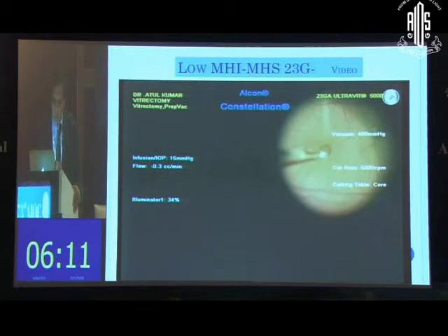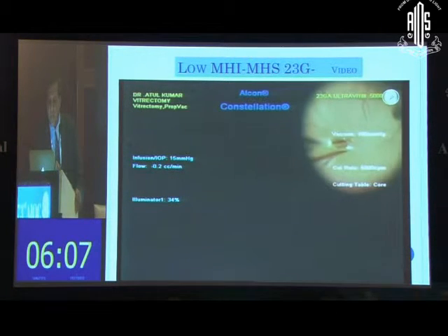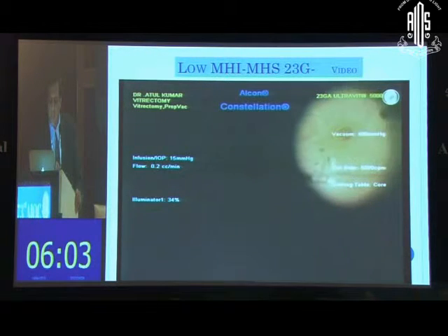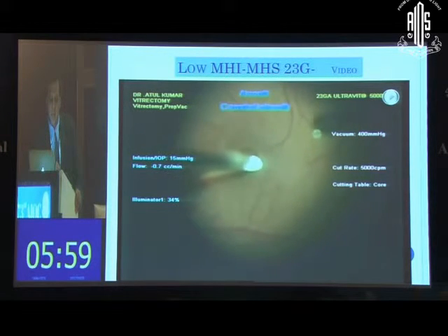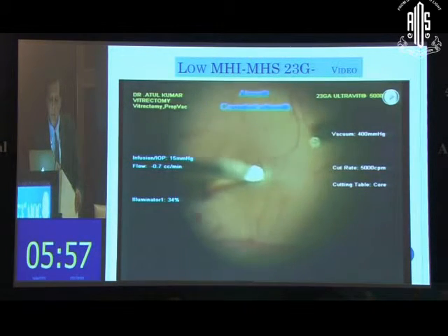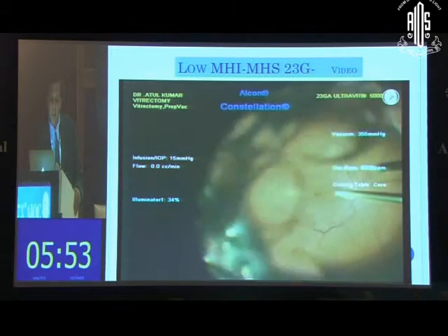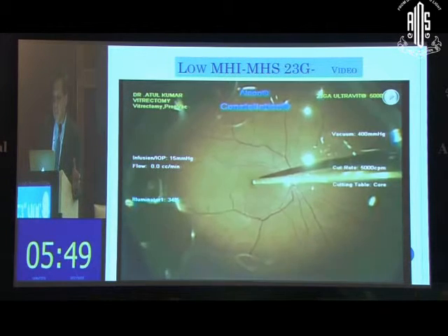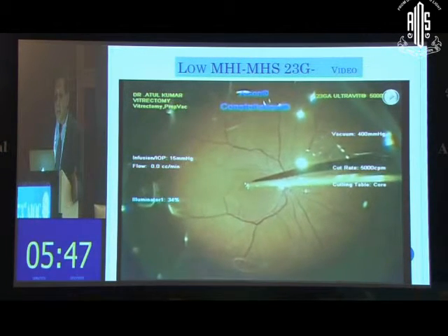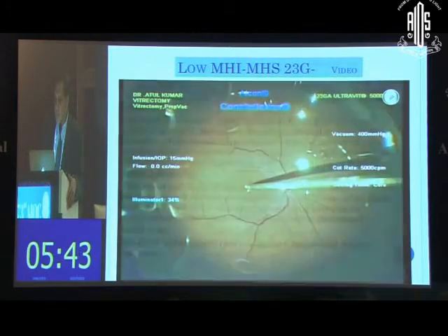Brilliant Blue G is squirted under fluid. You don't need to do it under air like Trypan Blue. After the peeling, for which you use a disposable ILM forceps, in holes it's generally better to peel a larger area of ILM. This is how we raise the height of the hole, so as to increase the intraoperative macular hole index to a value more than 0.5. For larger or flat holes the values are usually less, because flat holes don't have a good height. So we'll go on further.